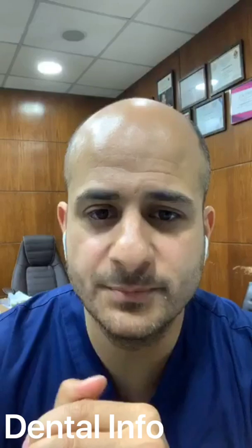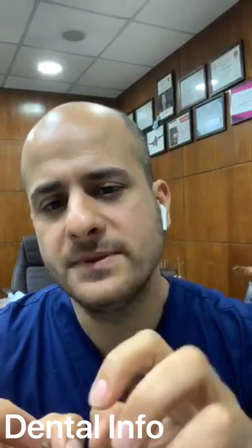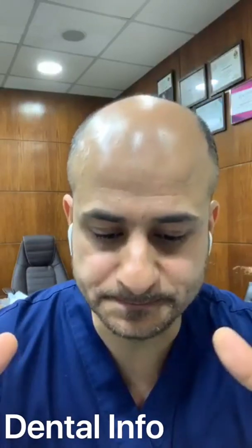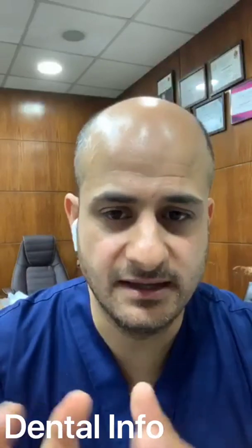Sunrise asks, if we try the cone and we like the tugback, but we cut it, what's the purpose of cutting the cone? I think I answered you. If you take an X-ray and your cone is 100% at the radiographic apex, and radiographically the apex and the canal are even, I recommend cutting 1 millimeter or 0.5 millimeter from the cone, because when you are compacting, the gutta-percha will expand somewhat. Because of that, I always recommend that with your last file you be precise and not open the apex more, because over-preparation and over-expanding the apex is not good for you.